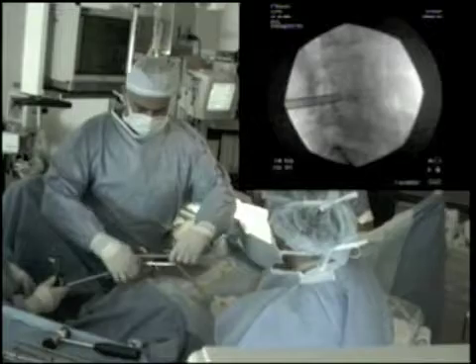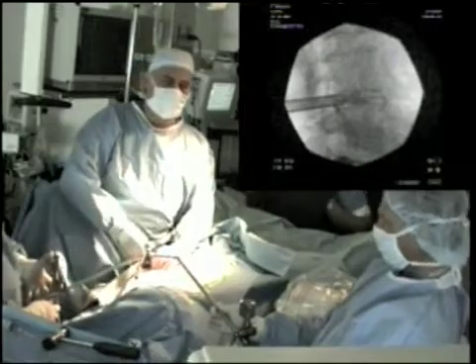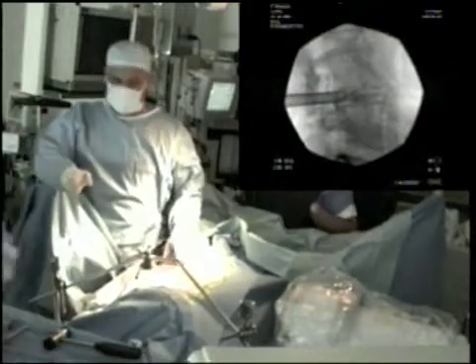the anchoring frame is attached to the table. Fluoroscopic images in the AP and lateral view confirm correct placement of the sheath.